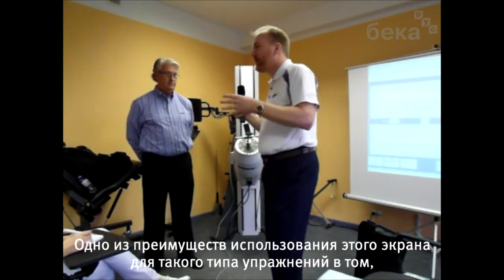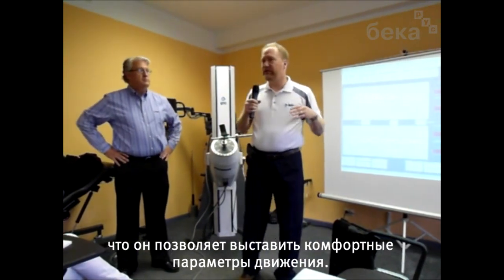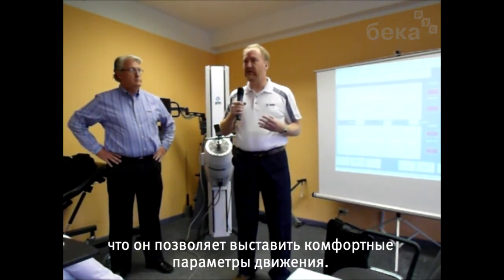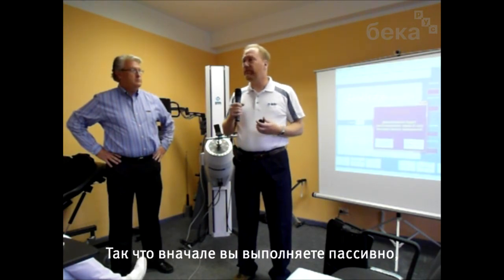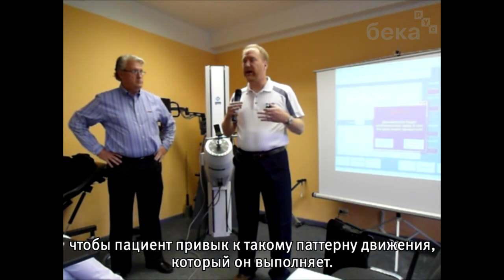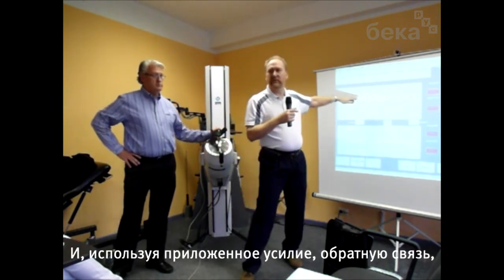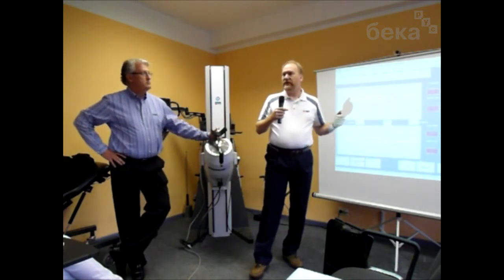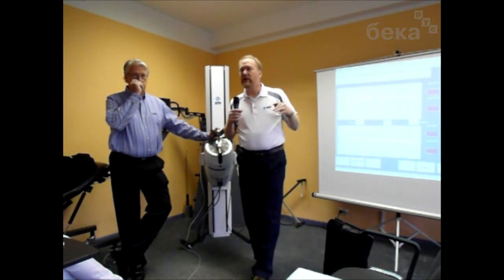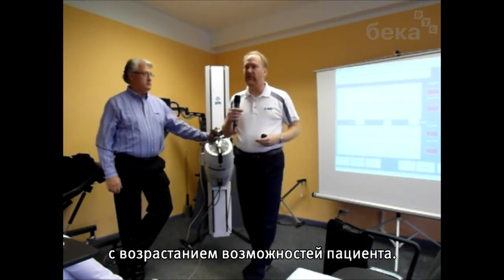One of the benefits of using this screen for that kind of exercise is that it allows you to set the machine up to move the person's limb through a range without any participation from that person. So you can do it passively initially, just to allow the person to get comfortable with the movement pattern they're going through. And then, using the force output feedback, teach them that yes, they can exert load against the movement of the tool, but you could start actually very low and build up as they start feeling more and more comfortable with their abilities.